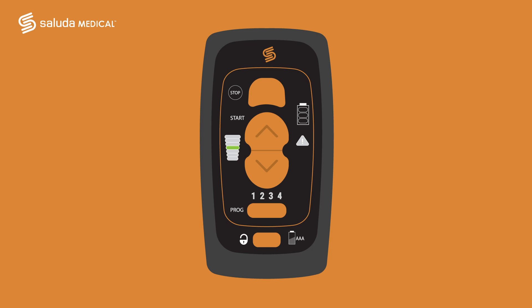When you stop your stimulation, one green bar will remain lit. The level that remains lit indicates the intensity level you had when you turned your stimulator off. To turn your stimulation back on, just press the up arrow button after turning your remote on. The stimulation intensity will gradually ramp back up to the same level where it was before you turned stimulation off.